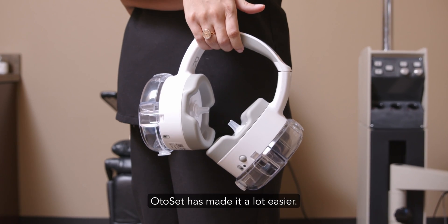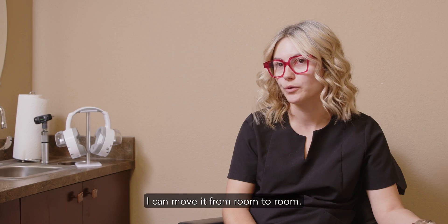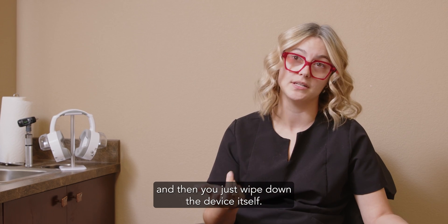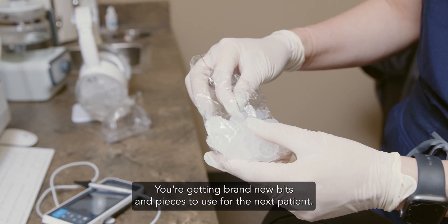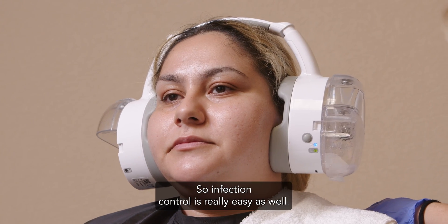Odoset has made it a lot easier. It's pretty hands-free. It's portable. I can move it from room to room. In what we're doing today in particular, it's been super easy because you just take the pieces off and throw them away and then wipe down the device itself. The cleaning takes all of two minutes to make sure it's really clean. You're getting brand new bits and pieces to use for the next patient. So infection control is really easy as well.